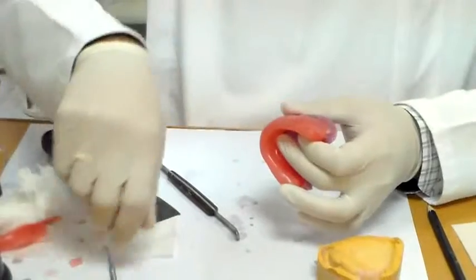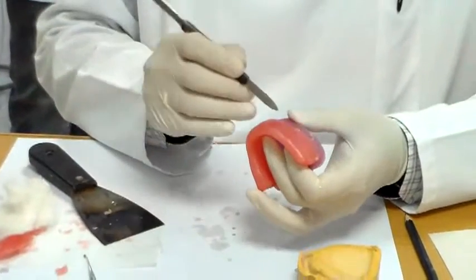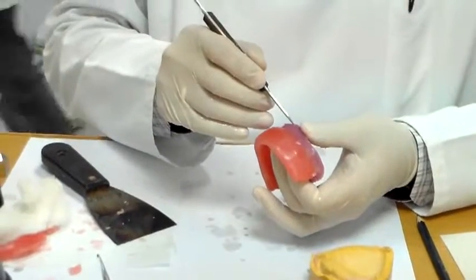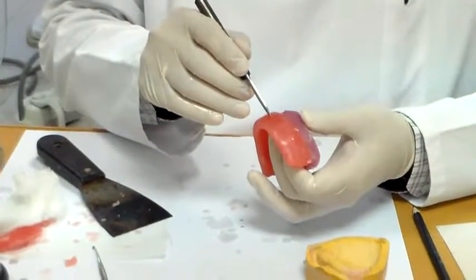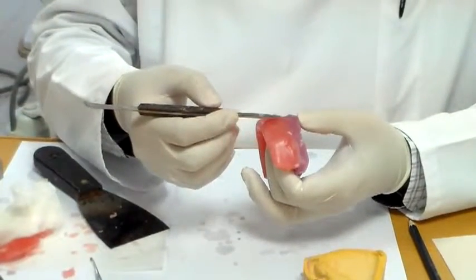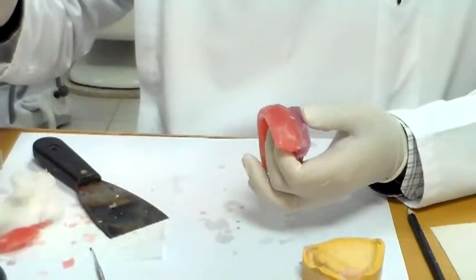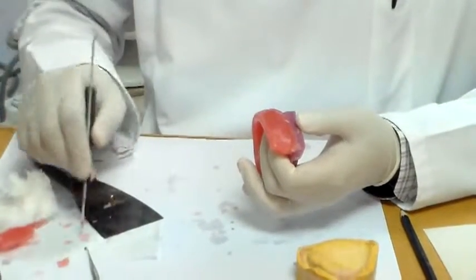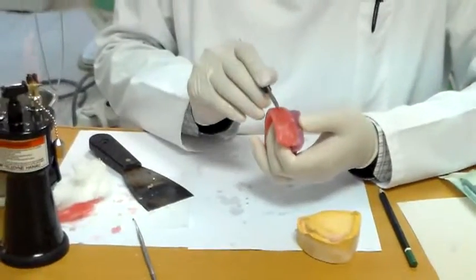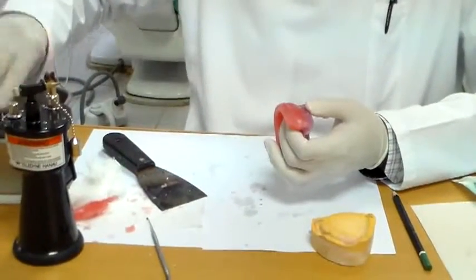The approximate height of the record occlusal rim by itself is about 10 to 12 millimeters. From here it will be about 22 to 24 usually. So you can measure it with a scale. Kind of 22 to 24 will be here at this location. Let's make a mark.